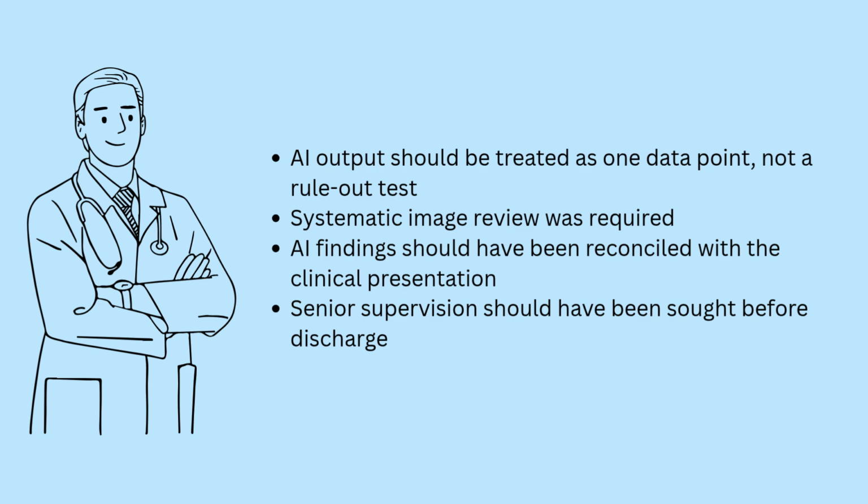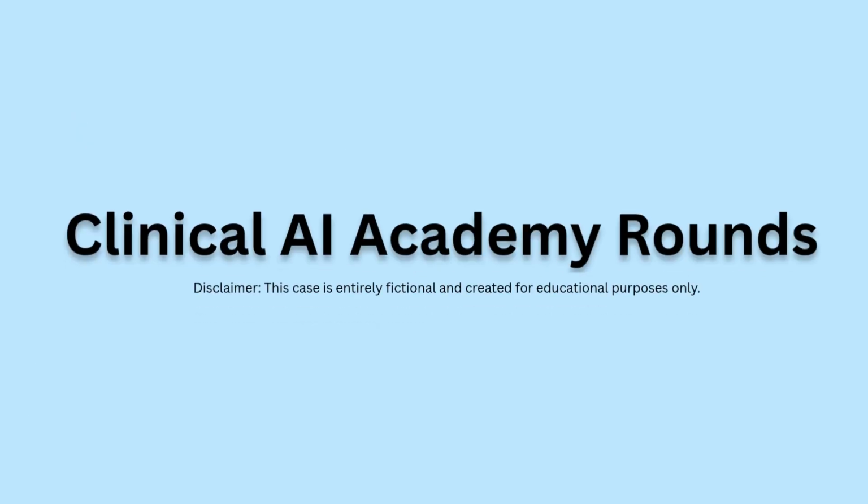The supervisor corrected the decision-making process. The AI output should have been treated as one data point, not as a rule-out test. The resident should have performed a systematic image review, reconciled the AI result with the clinical picture, and sought senior input before discharge. How would you have approached this case?